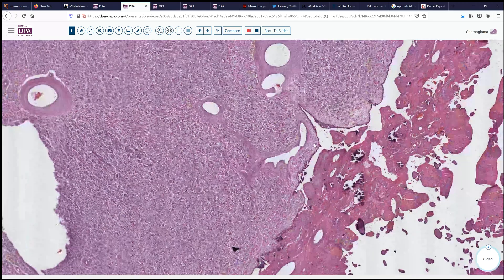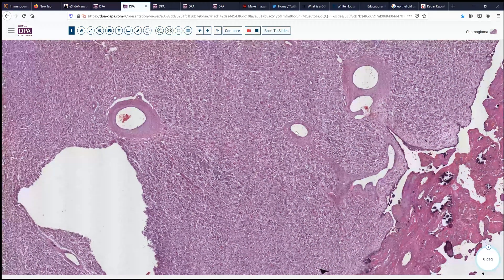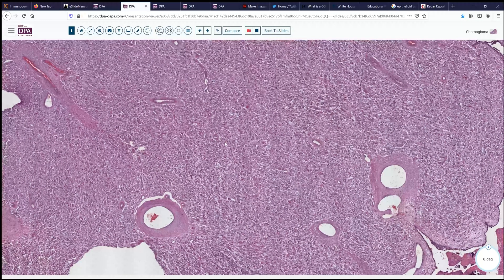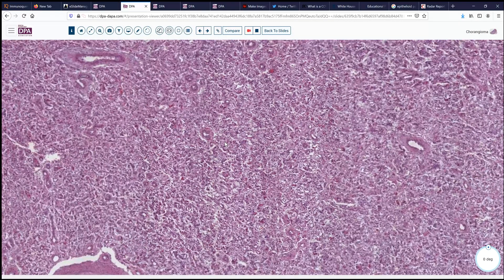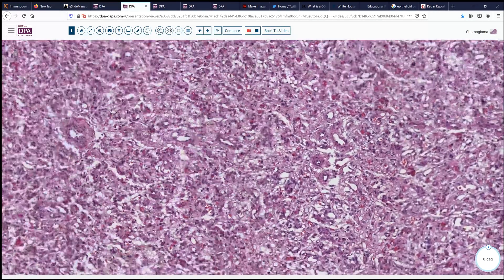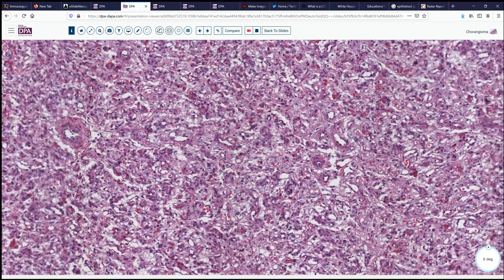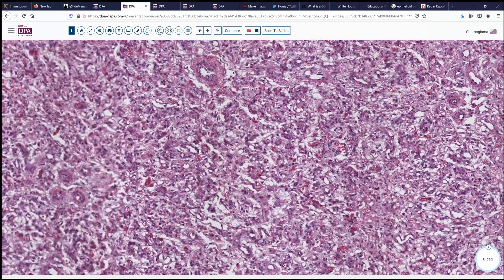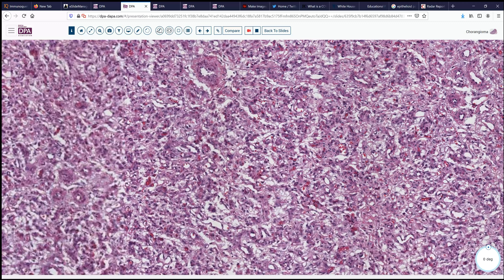Moving over onto the lesion itself, we see a mixture of vessel sizes — some intermediate size vessels, some stem vessels, and some smaller branches. This intervening tissue appears to be quite vascular, with a lot of small capillary-sized and intermediate-sized vessels. There is no normal villus structure here and no maternal type circulation involving this tissue.